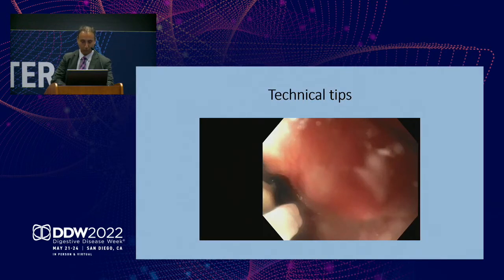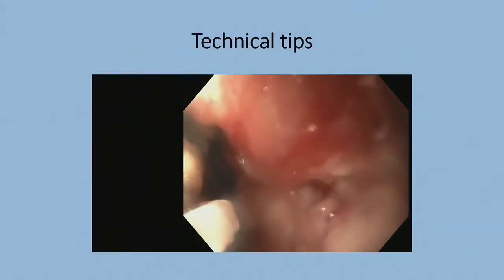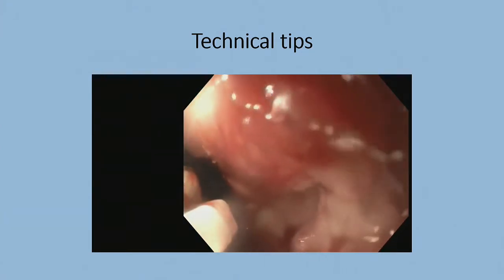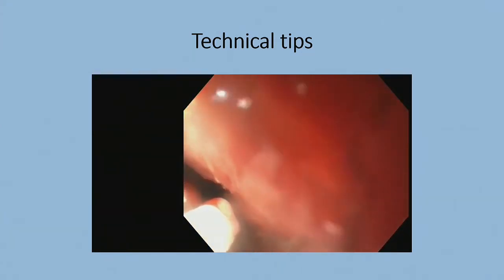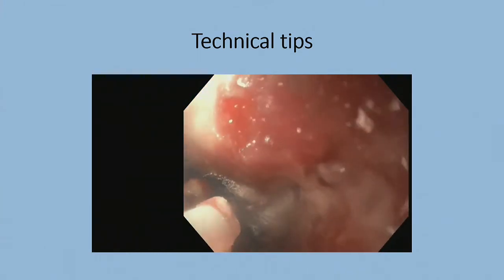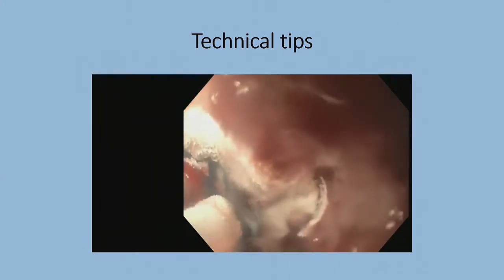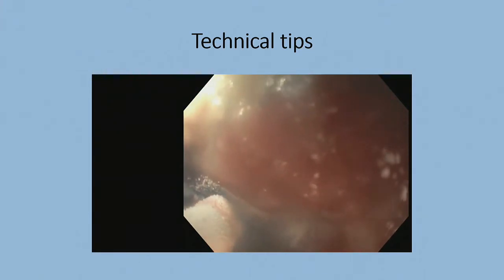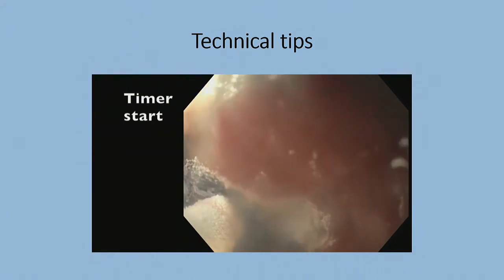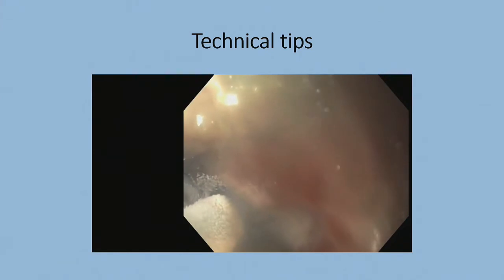I'll show you how it's done for cancer. So as Dr. Kaul mentioned, this is a non-touch modality. You see the catheter coming out of the scope and the area being conditioned for freezing. We move around. And if you dry your channel very well, your scope typically will not freeze. And then as I'm spraying here 2 centimeters of the tumor, when the area is entirely frozen and white, then the timer starts, and we go 30 seconds, and after thawing, we repeat it 3 times.